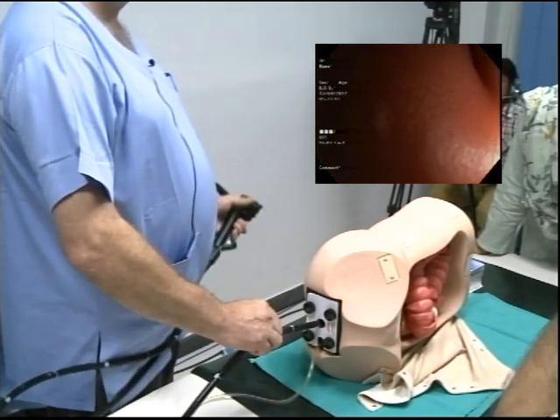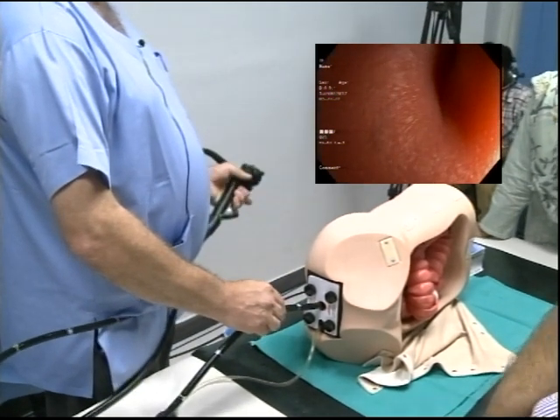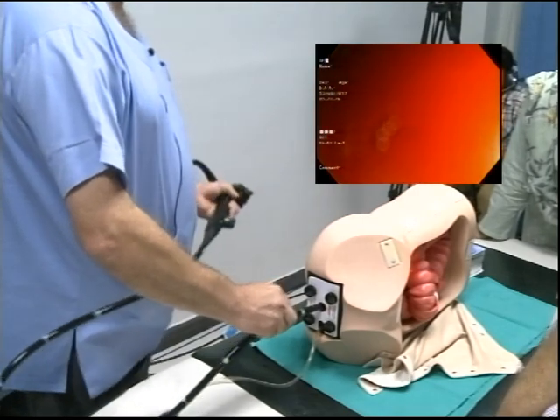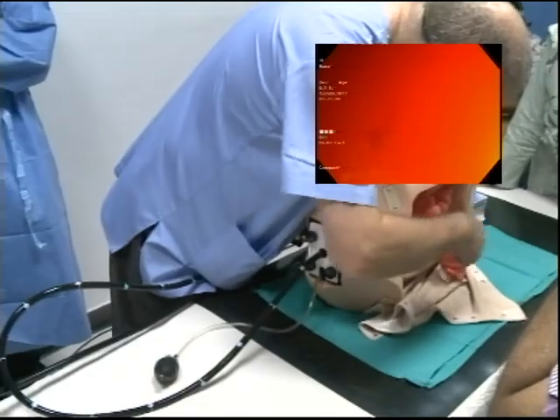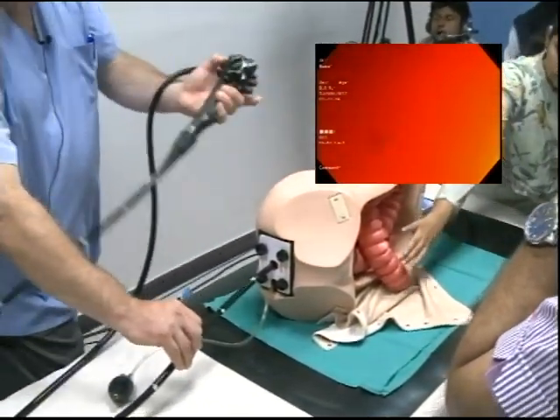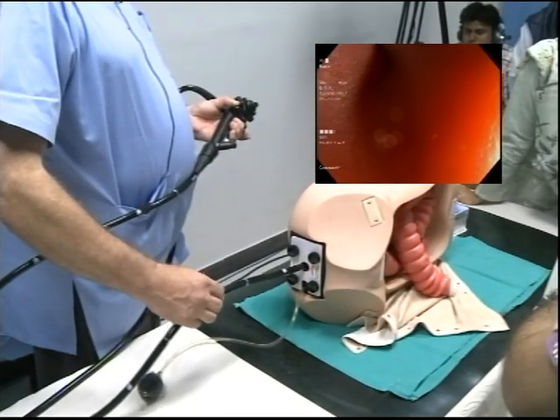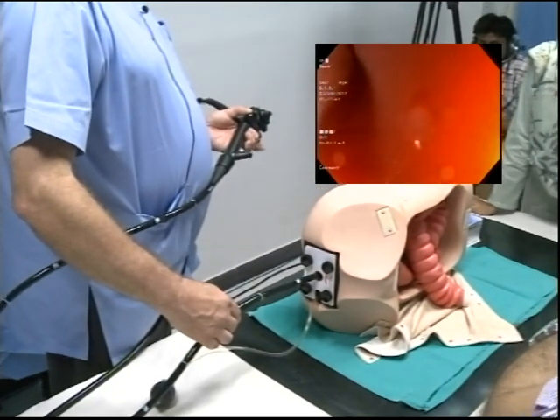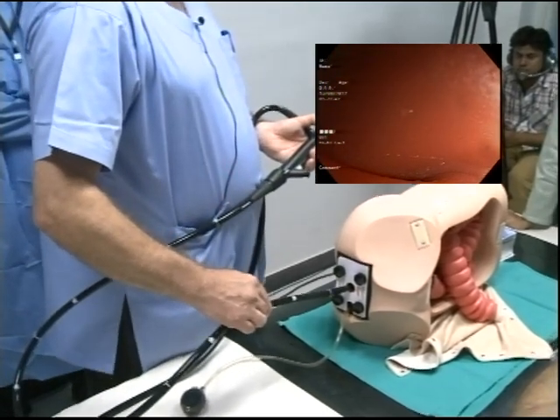Big wheel back. Let the scope look. And as you go forward, and wait. Now, when you've got a patient, you'll find that they actually do have skin over their abdomen. And you'll see here, this will stop. But can you see how it's actually going straight? If we actually put the cover back on, it would actually go forward. Now we just wait. If you wanted some air, you could put some in. Anti-clockwise, slowly draw the scope back.